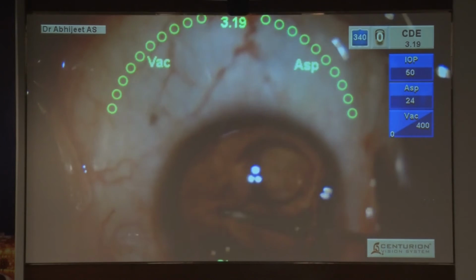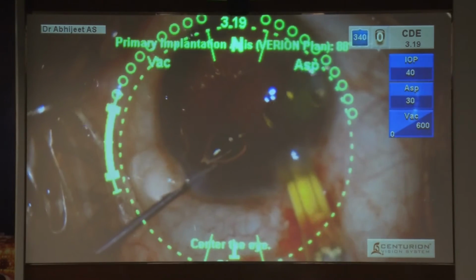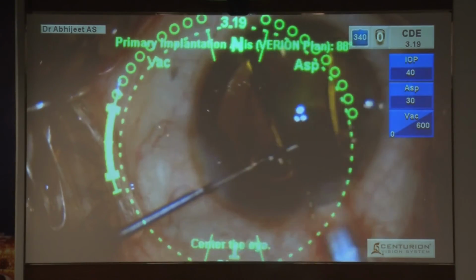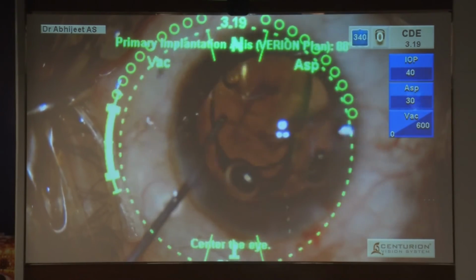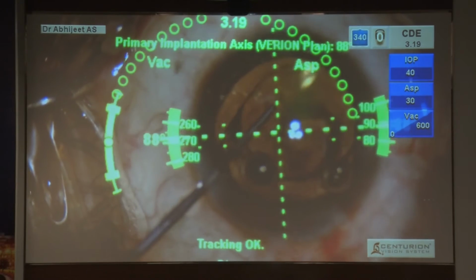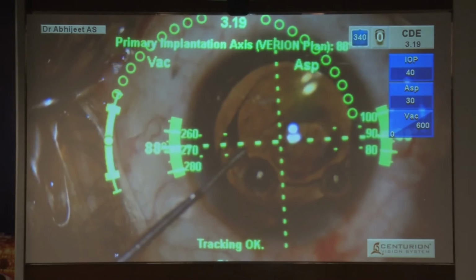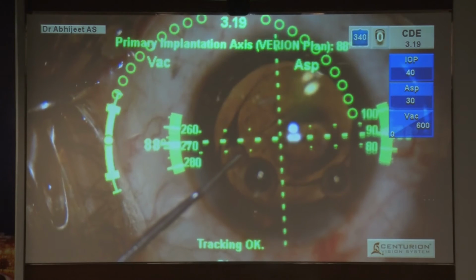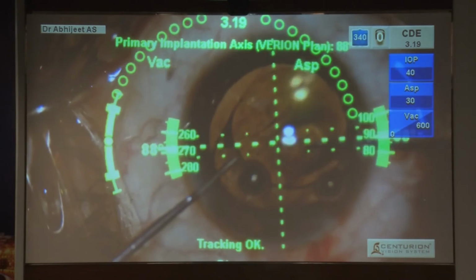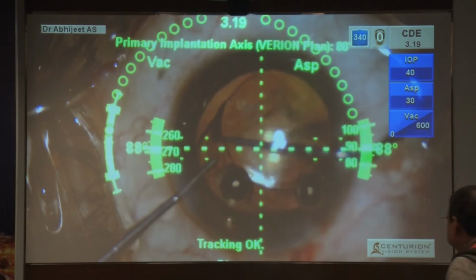So now I take a deep breath, pause, and now I think, what am I going to do? So I say, let's try this. If not, then I'll have to explant it. So I put the IOL in the area which is intact first. The haptics go in. My IOL gets placed in the axis. And I attempt to do an anterior optic capture for this.